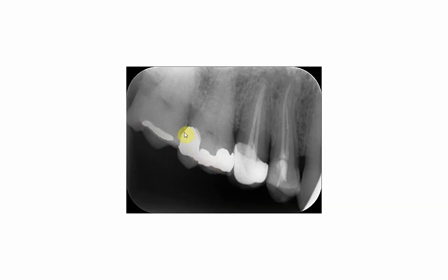If you compare it to the MOD amalgam filling, you will see that the radio-opacity is much more in the amalgam filling. You can see that the amalgam is extending from the mesial surface of the upper six to the distal surface, and underneath the distal filling box you will see a material that has a lesser radio-opacity than the amalgam filling.